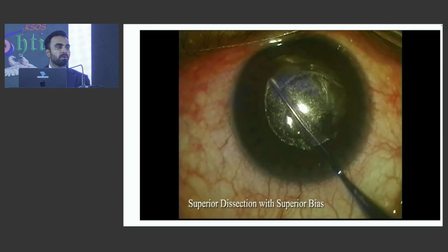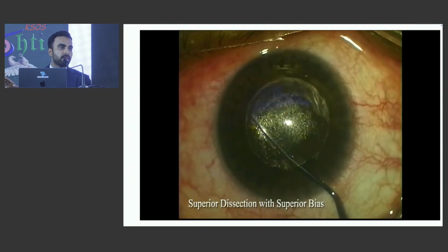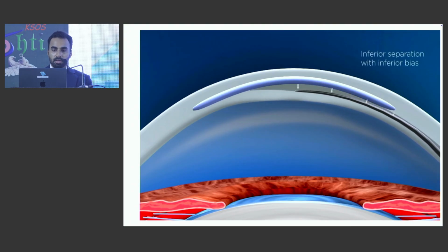And you have to move like a windshield wiper. Don't move from side to side. You have to move like a windshield wiper, pivoting within the incision, so you ensure you don't tear the cap at all. Now, here comes the catch.